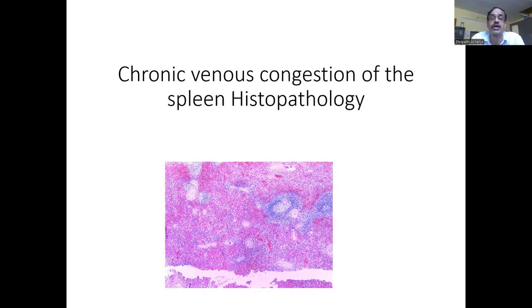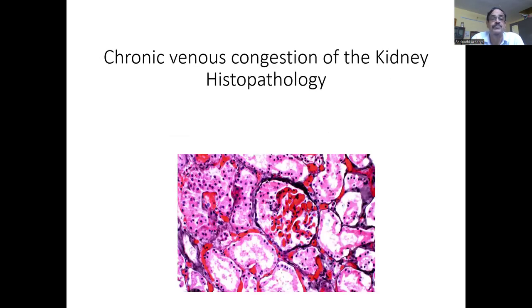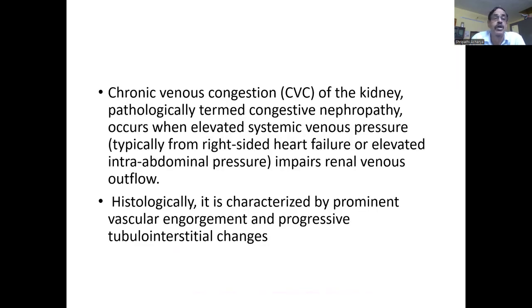Chronic venous congestion of the spleen. Next, chronic venous congestion of the kidney.